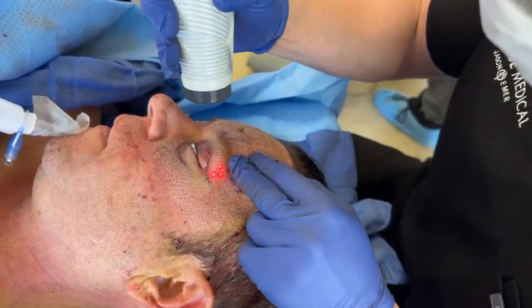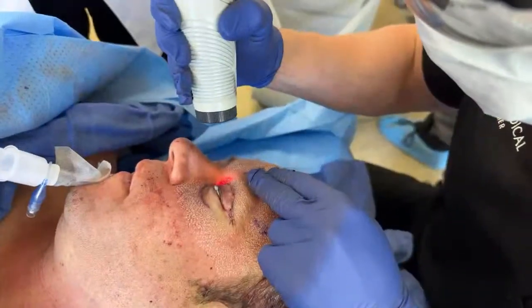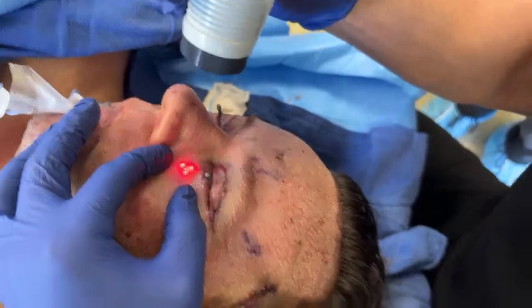Let's know about doing Morpheus 8 as well. Yes, we just did it before. It's how we layer our treatments. We're going to do our microneedle RF first, then our most aggressive lasers at the end. You guys can see we have metal shields in here protecting his eyes.